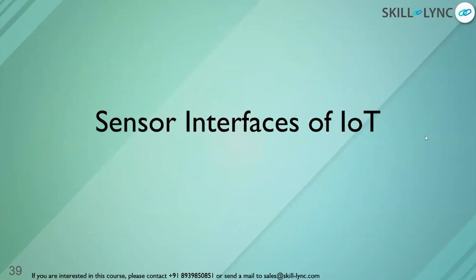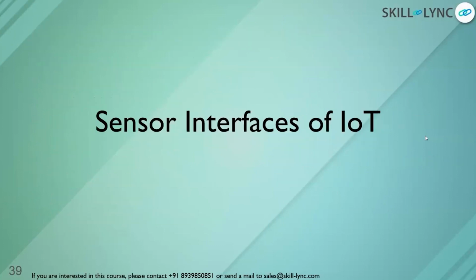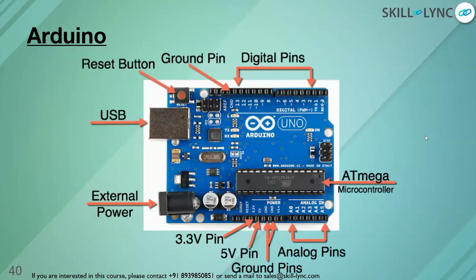So here comes our topic of interest. We have seen these are the parameters monitored using wearable devices. As a biomedical or healthcare engineer, in medical technology, we are concerned about the sensors, how these sensors are built in, how these sensors are interfaced to the devices, how the parameter is monitored. In order to interface the sensor to a device, we need some kind of microcontrollers or microprocessors to take up that.